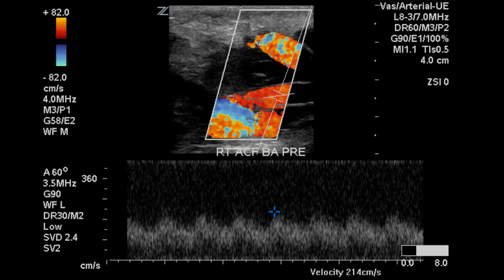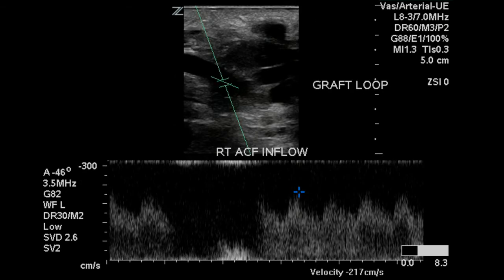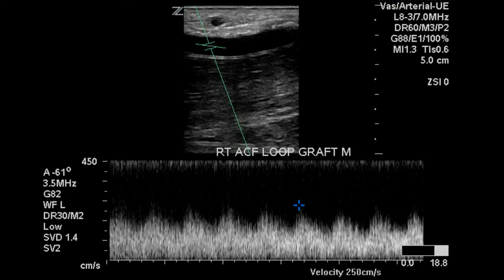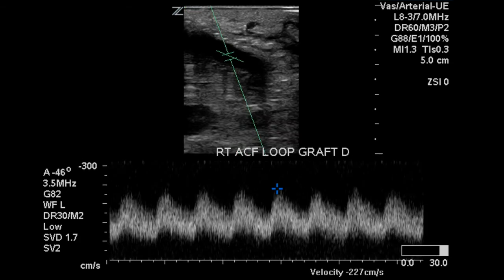Here's the brachial artery again, prior to the anastomosis, and at the proximal graft. Throughout the graft, we can see the same flow pattern demonstrated with velocities in a similar range.